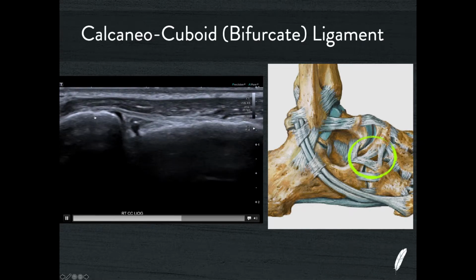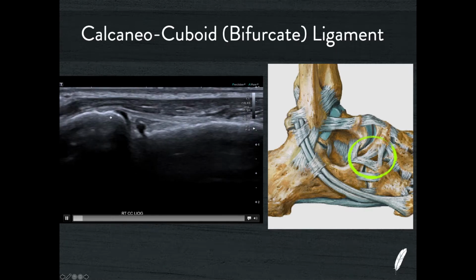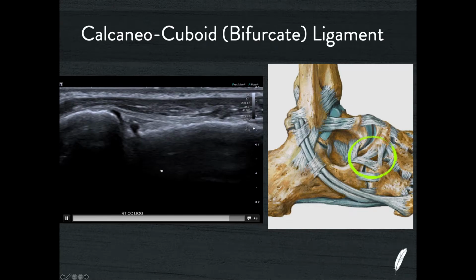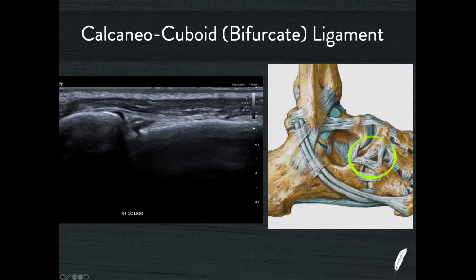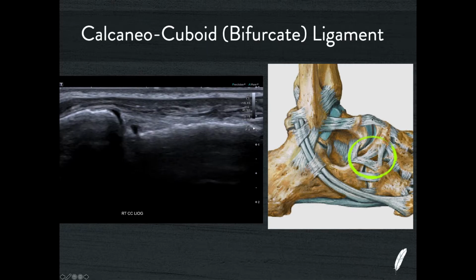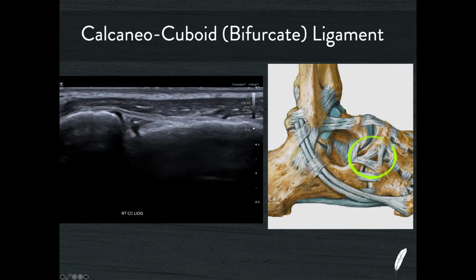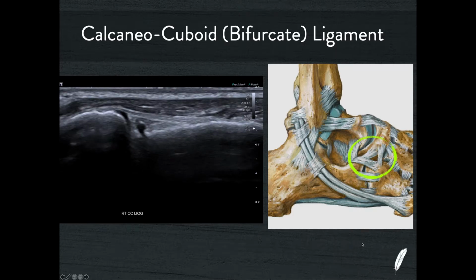And when it fails, it very commonly takes a fracture from this anterior tubercle of the calcaneum, and this is very difficult to see on a plain radiograph. Of course, when you have a fracture here, then you very commonly have concurrently a dorsal talonavicular injury at the same time, because of course this is that Chopart line through the foot.